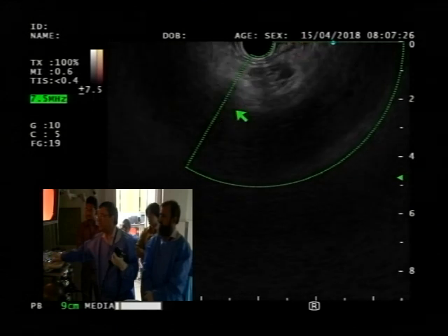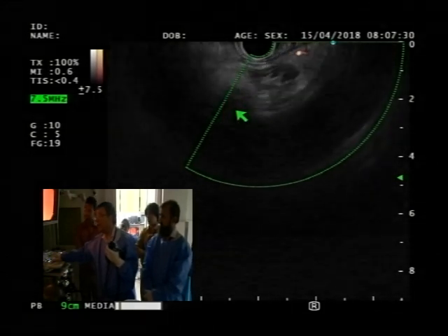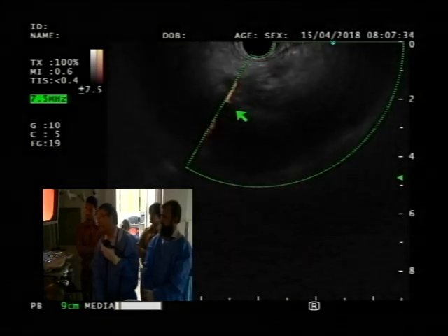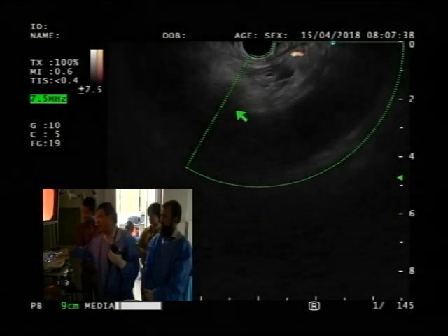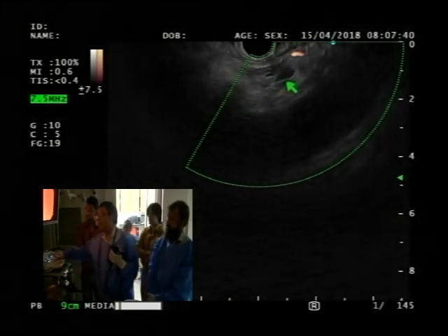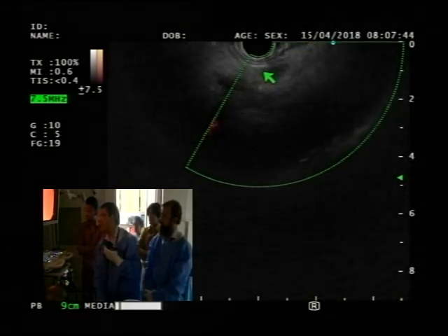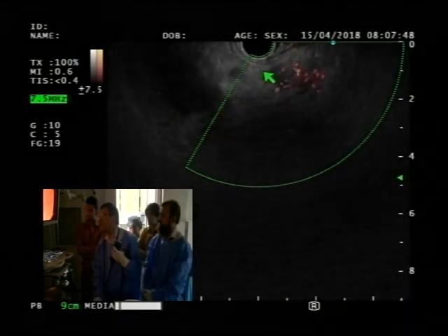Does anybody notice anything here, like with regard to the pancreas? Do you see any pancreas there? Yeah, it's an atrophic pancreas. Extremely atrophic pancreas, yeah. This area is of the pancreas right here, but there's really no major pancreatic tissue. That's what it looks like right there.